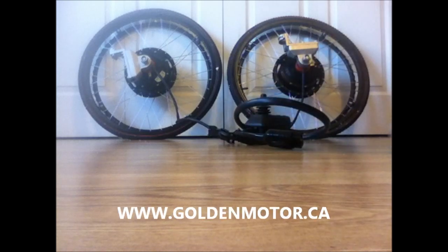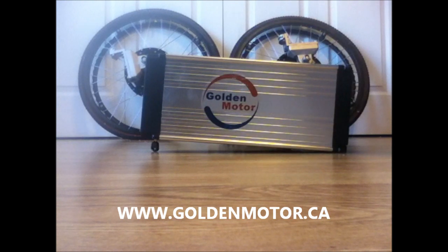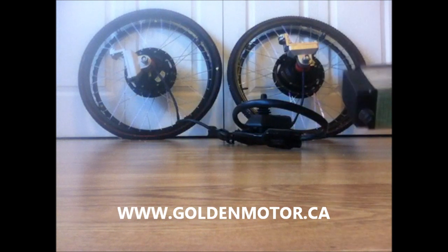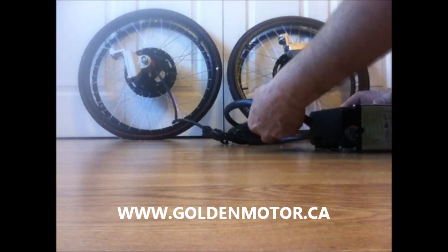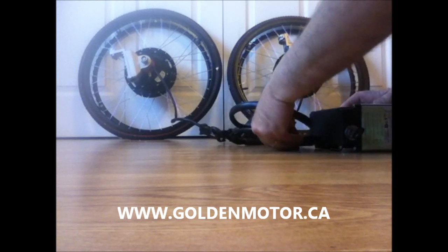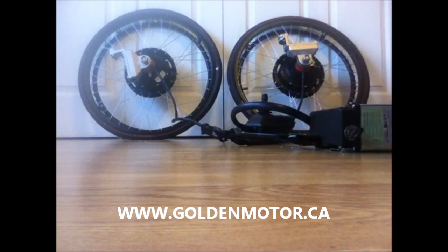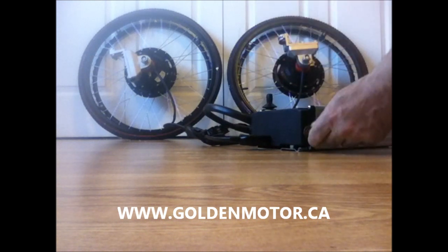Now we have another cable here for the battery. I have a Golden Motor 24-volt 20-amp battery — you would go a long way on a wheelchair with this battery. And this battery simply plugs in right here. So there we go: three plugs. Each wheel is plugged in and the battery is plugged in.